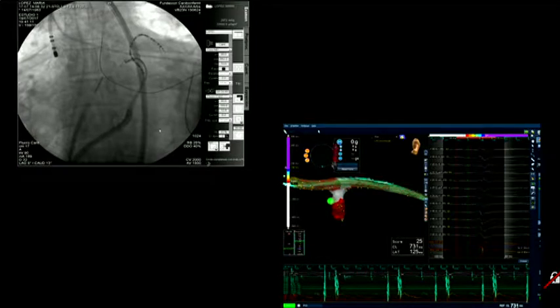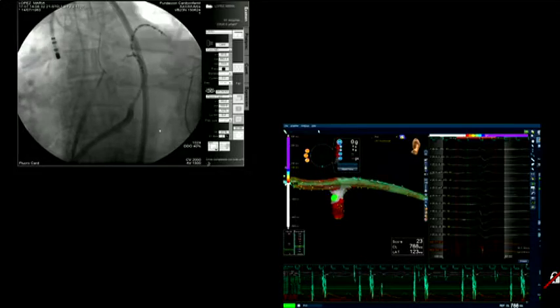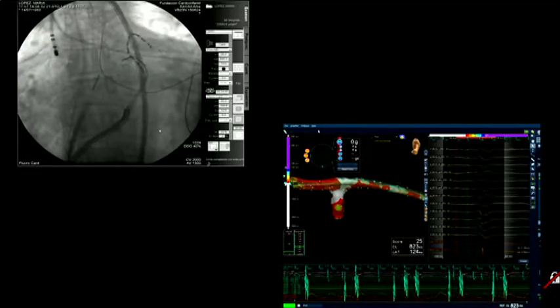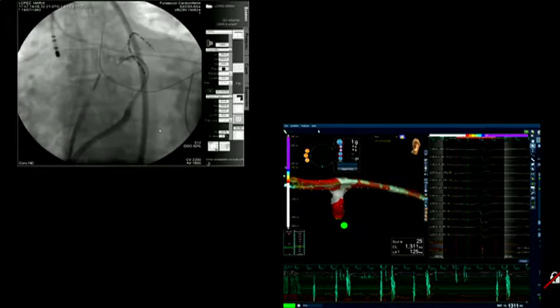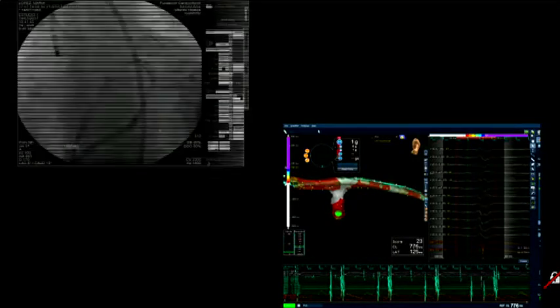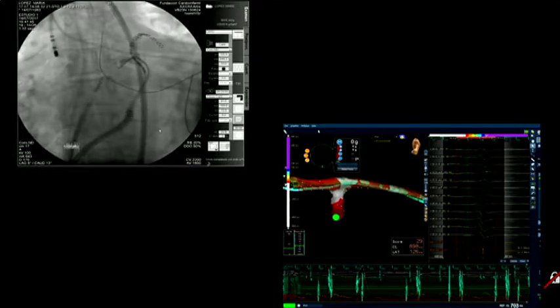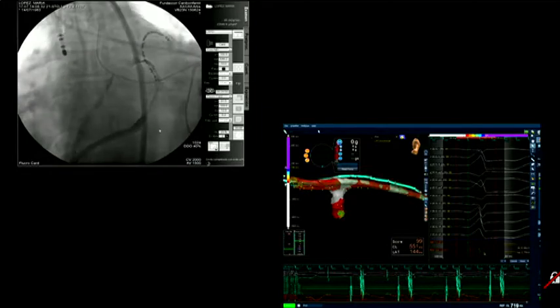So it seems to me that Fermin has the cannulation of a branch, and when you inject contrast, you can see everything intramurally. We see the staining of the myocardium. That stained myocardium would be treated with alcohol. And we could consider, if the signal is good, yet to be confirmed, because we don't have any more extrasystole. No, there is an extrasystole. No. We are too deep, I think. We are too deep.